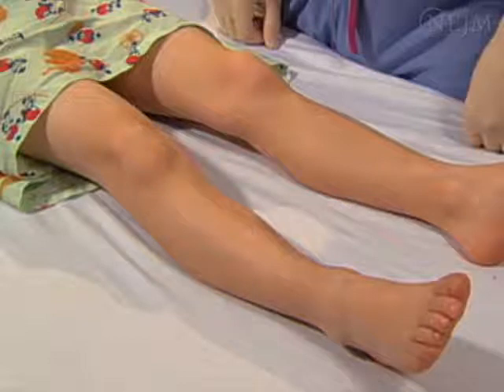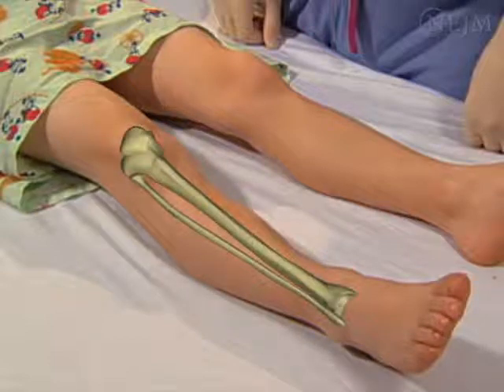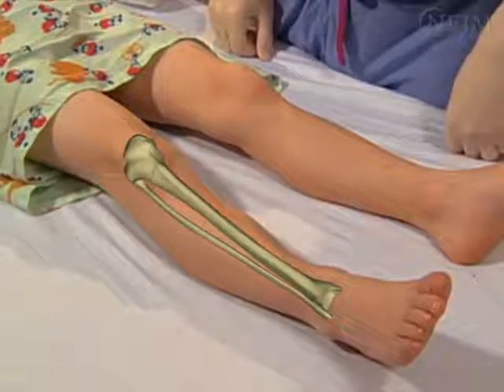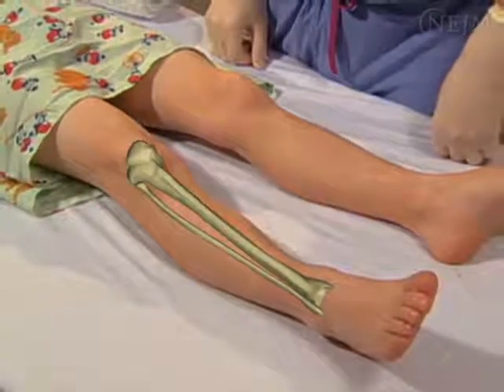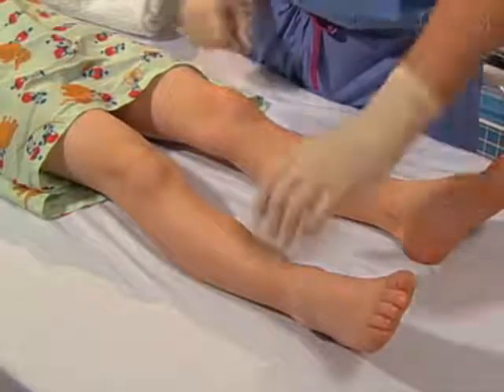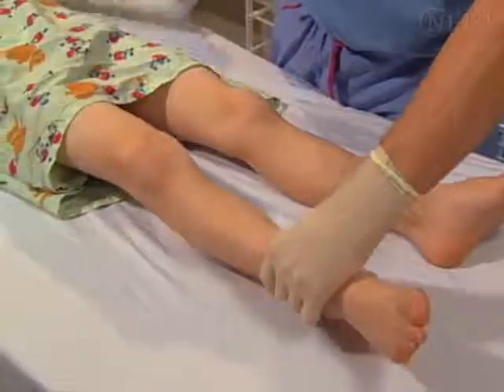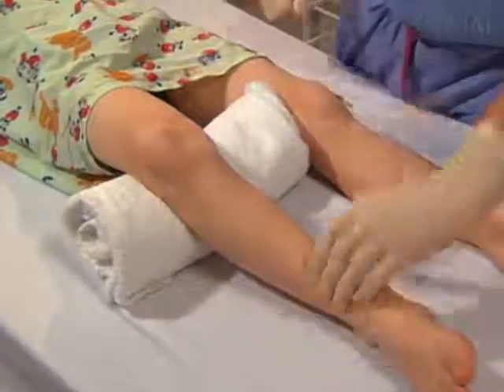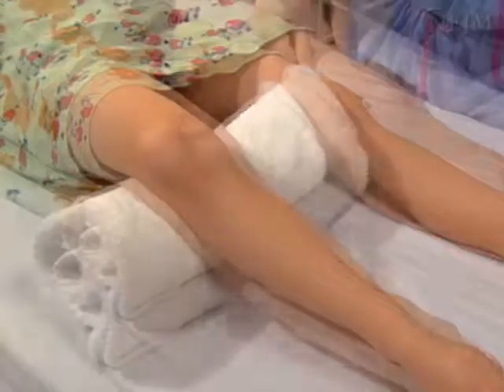The proximal tibia is the preferred site in children, since palpation and identification of underlying bony landmarks is less likely to be obscured by large amounts of soft tissue. In addition, this location is remote from the head and chest, where airway management and chest compressions may be ongoing in an emergency situation. Slight external rotation of the leg and placing a towel roll under the popliteal fossa may be helpful to flex the knee and maintain stability of the leg.